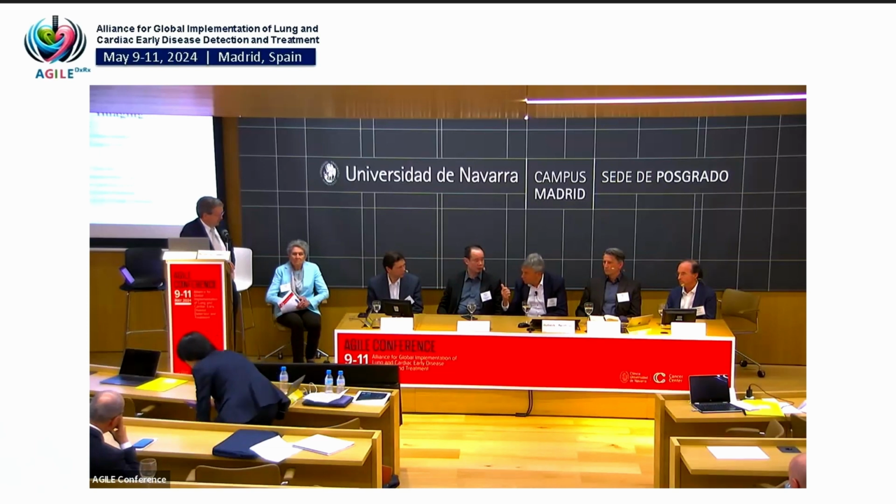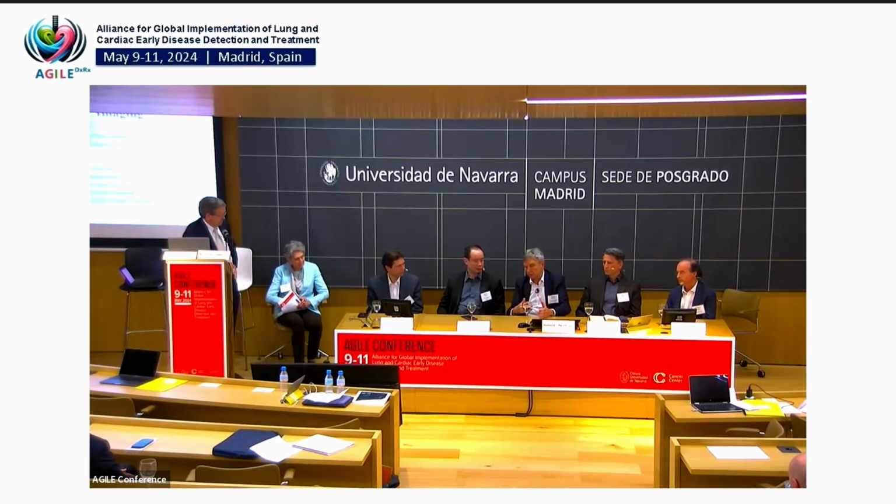And what we showed also here, if you look at the comparisons, we did it altogether now in a few thousand, and that's huge, that you can do it so well without any correction in heart rhythm, no beta blockers, no ECG triggering, within an interval of 3 months is amazing, I think.